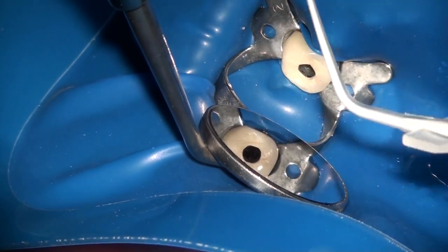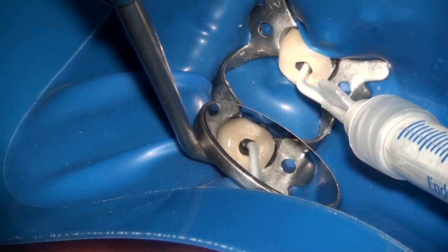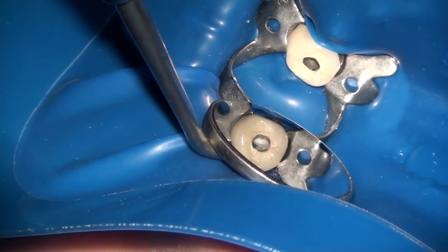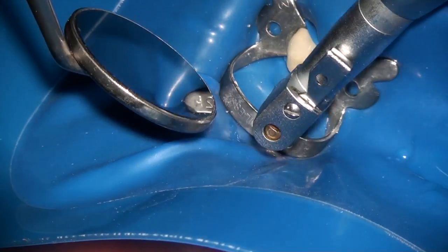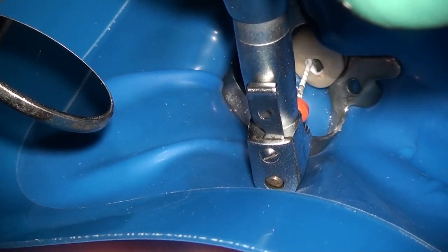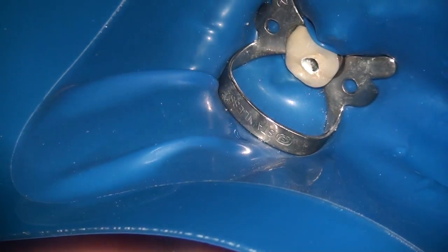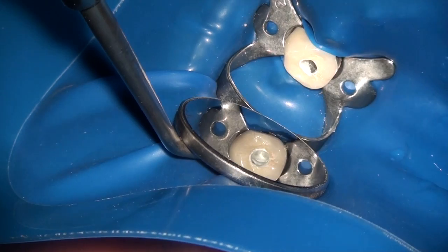Now we're ready to obturate the tooth. As you can see, we have access through the crown and the tooth has been isolated. I'm using the advanced obturation technique here with direct injection into the tooth. Once the bioceramic sealer is injected, the MacPak 25 tip is rotated at about 600 RPM, approximately one millimeter short of the apex in each canal. You only want to rotate at 600 RPM and not higher, because a higher RPM can be very dangerous in pushing material out.